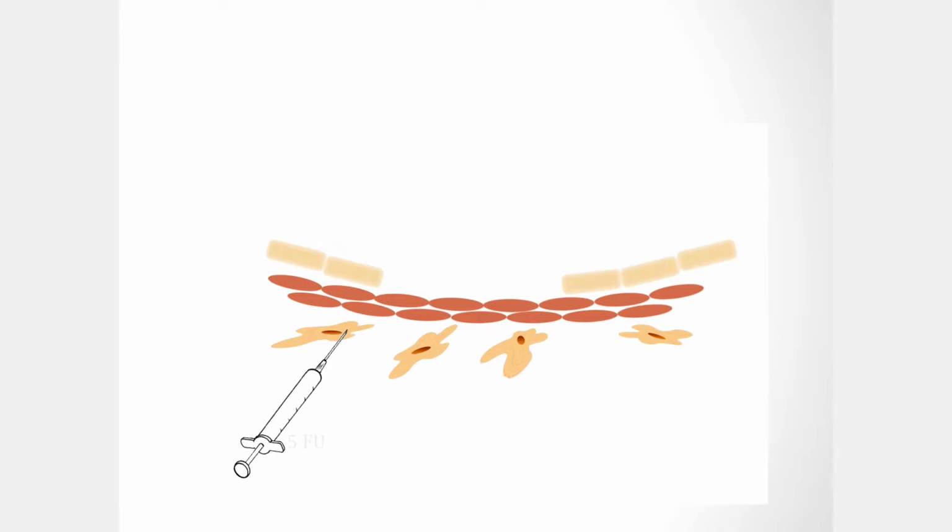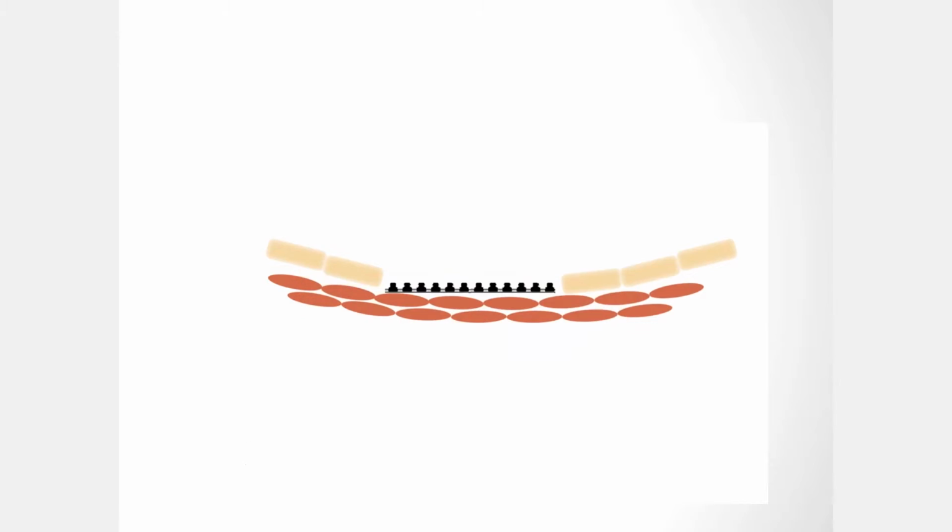The modified technique allows for the anti-scarring medicine to be placed with the syringe, and this scarring medicine then prevents much of the scar tissue from forming. Subsequently, at the same procedure, we then use tissue glue, which is almost like a peanut butter and jelly sandwich, where we combine the 2 parts to actually glue, biologically seal the mucous membrane graft or whatever graft that we're going to use to expand the socket.